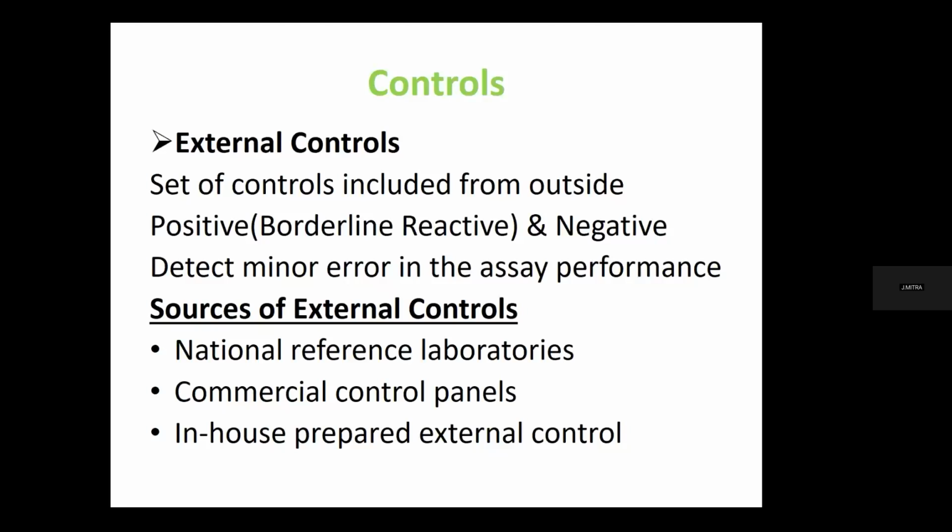So what are in-house prepared external controls? In case of ELISA, there is a standard protocol mentioned in any quality manual or NBTC textbook, but not for CLIA. So CLIA is lacking the standard protocol on how to prepare the external controls.